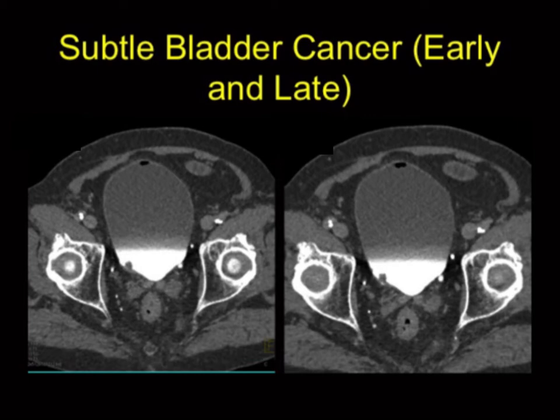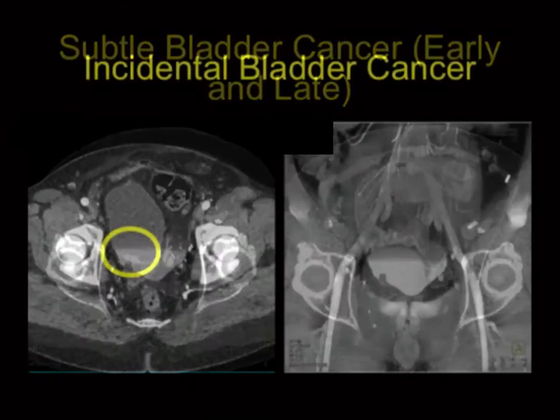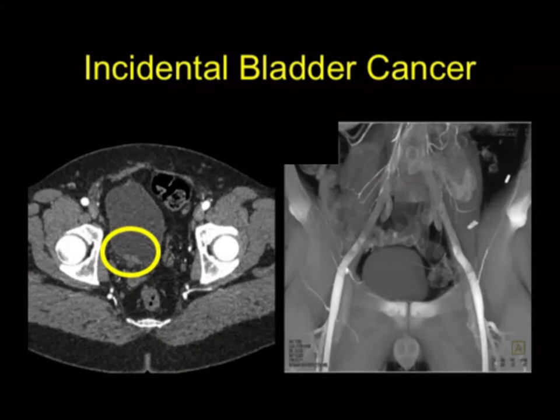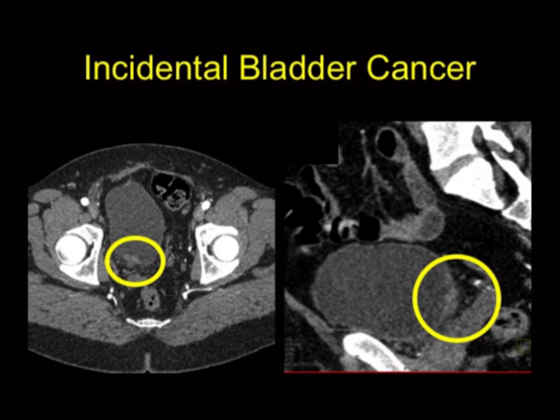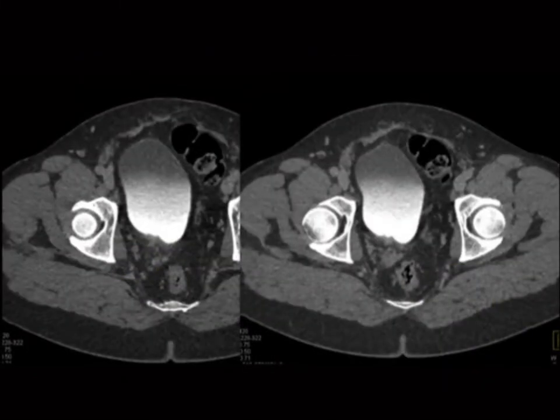In this case, you see little enhancement posteriorly — maybe it's averaging with the prostate, maybe not. On the sagittal view, there it is: an enhancing lesion, about a centimeter in size. Posteriorly, you tend to assume partial averaging. It's not partial averaging — it's a bladder cancer. When I put the circle there it's much more obvious. And look at delayed phase imaging — look how hard it is to see.